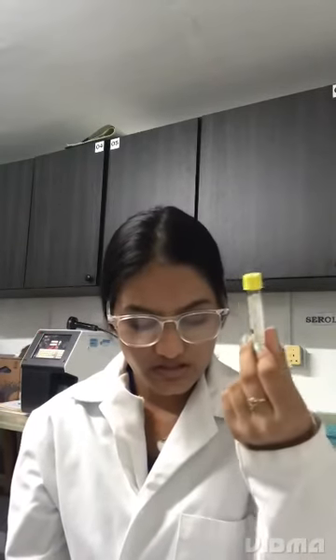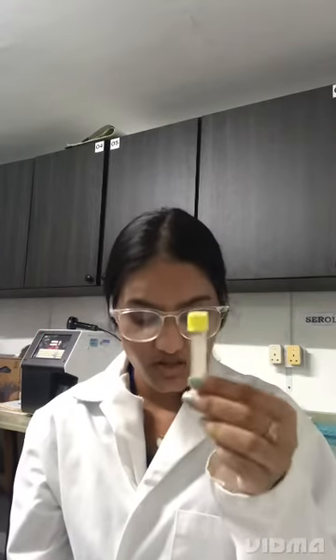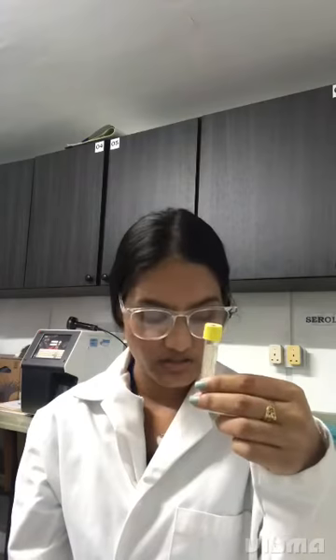The green top contains heparin, an anticoagulant, and this is also used in the chemistry department. The yellow top contains clot activator and serum gel separators, and this is used in various departments such as the serology department, the chemistry department, and the immunology department.